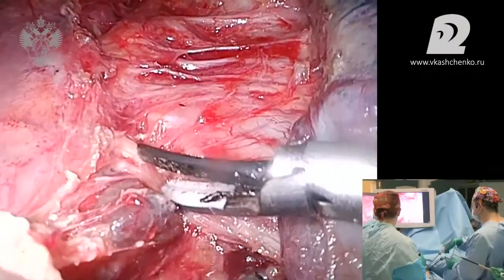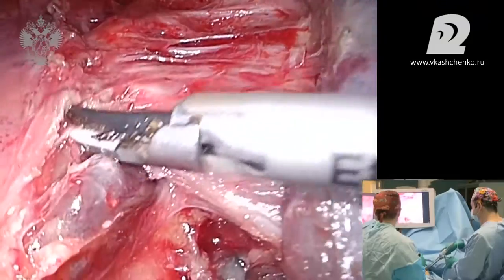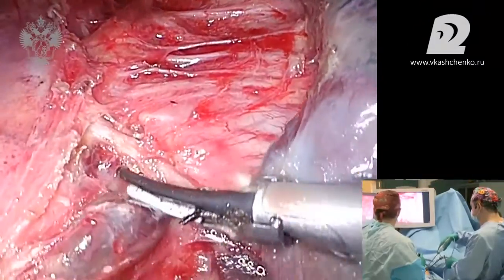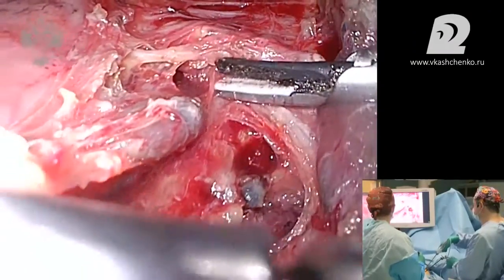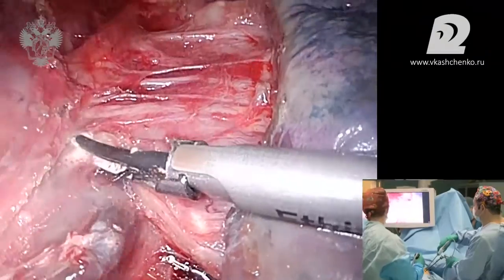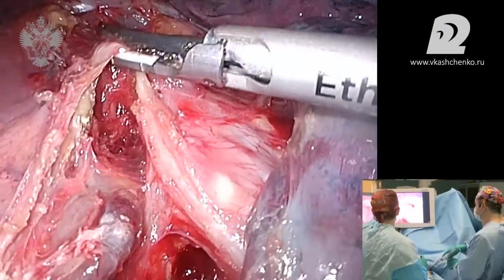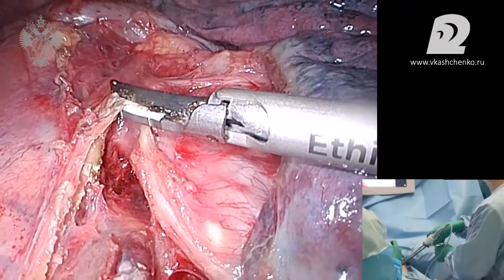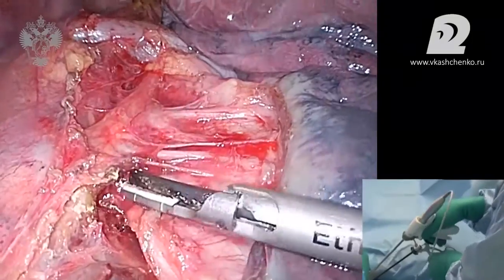It's a margin of the middle bronchus. Can you see it? Thank you. You can see how this lymph node goes under the bronchus. It's not alone here. Okay, now we have changed from laparoscopy to thoracoscopy. And you can see the difference in operating these two new devices, Thunderbeat and the harmonic. They have something in common, but they work differently, and I think that our specialists can consider the details and the sophistication of all these operations.